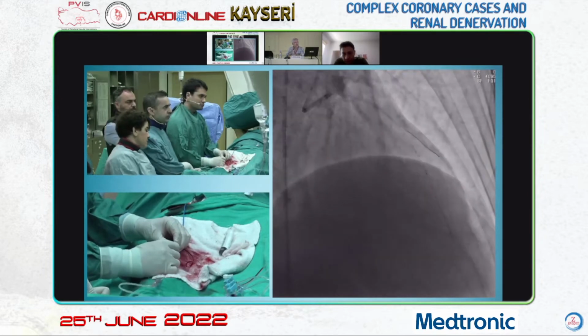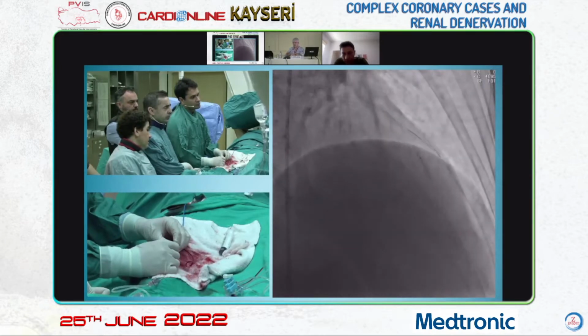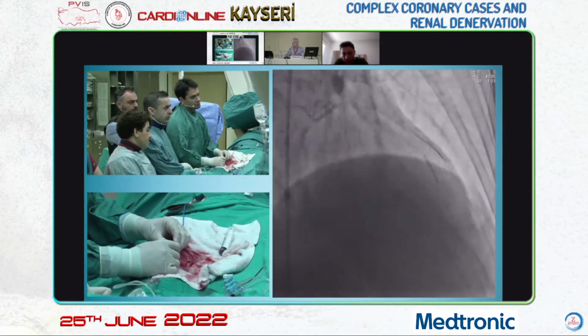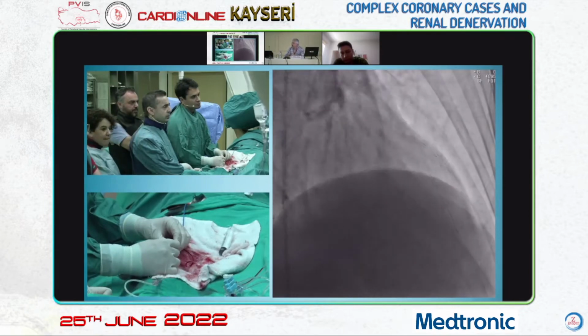Let's inflate. I have a question to Nihat.